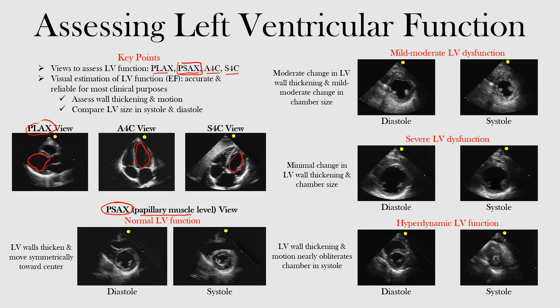Normal LV function looks like this. Notice the LV cavity in diastole — it's open; the left ventricle fills up with blood. Then in systole, when it's squeezing, it collapses and the cavity gets smaller. That's normal. The LV wall thickens and moves more centrally toward the center of the left ventricle as it pumps blood out — so it goes from larger in diastole to smaller in systole.